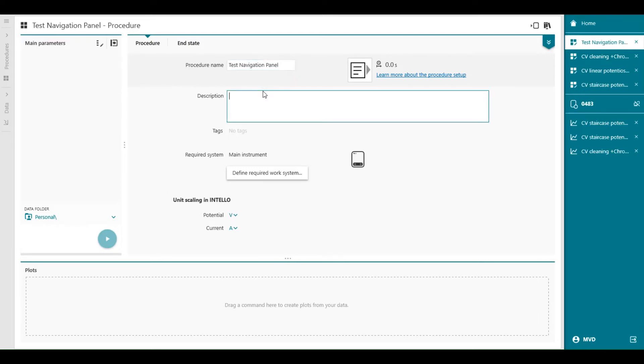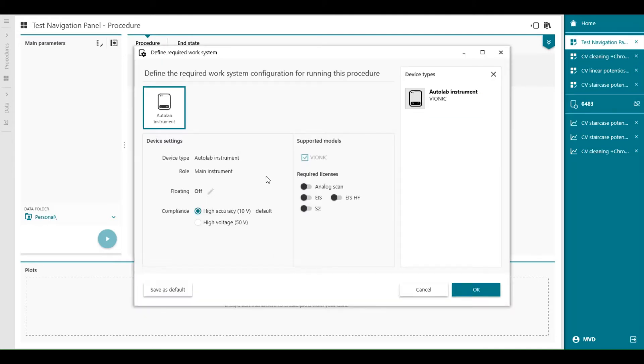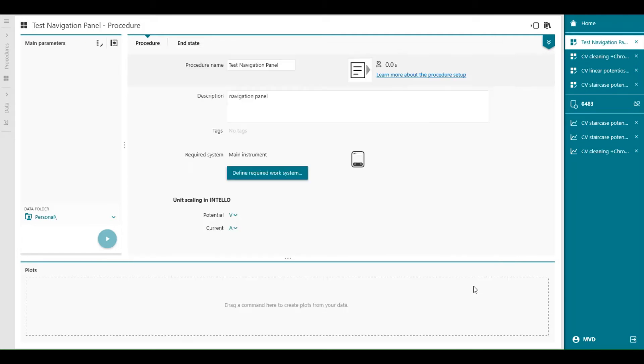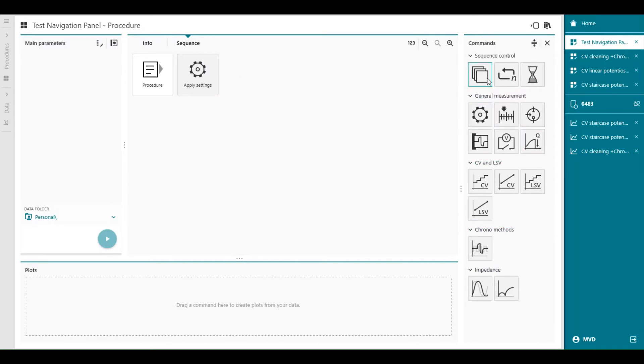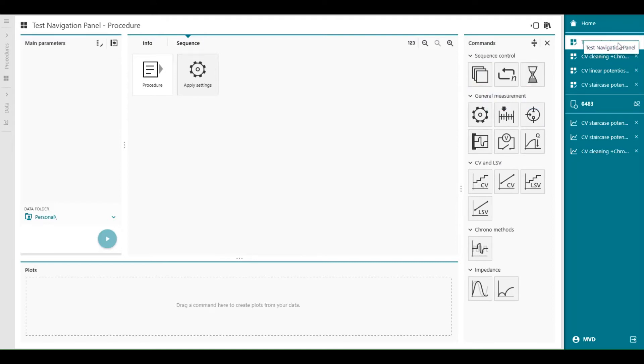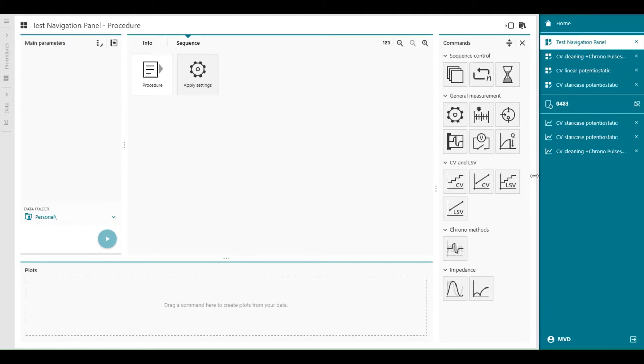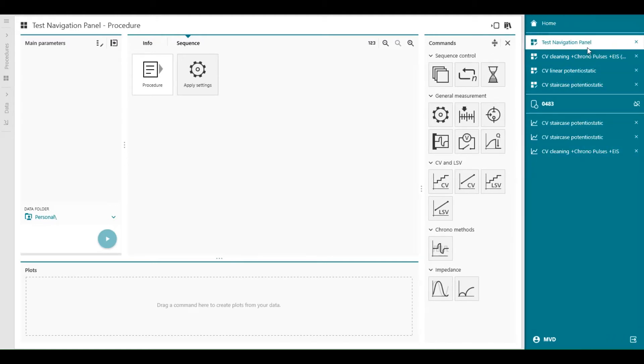And type in description navigation panel, like this. You can define a work system, high accuracy and what kind of other modules we can select. And then we can start to build the procedure with the commands available in this column. And you can see that the test navigation panel is now available as in preparation.